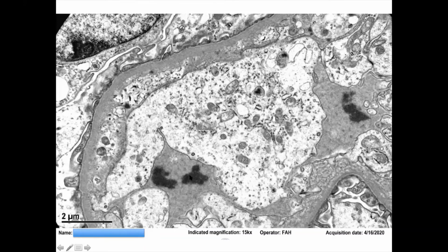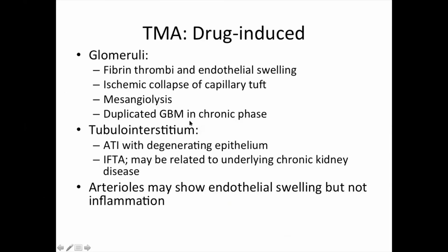And why are we ignoring them? Because we didn't see them on the IF, and also there aren't a lot of them on EM either, so we're not going to pay a lot of attention to these. All right, so this is a TMA that is drug induced.